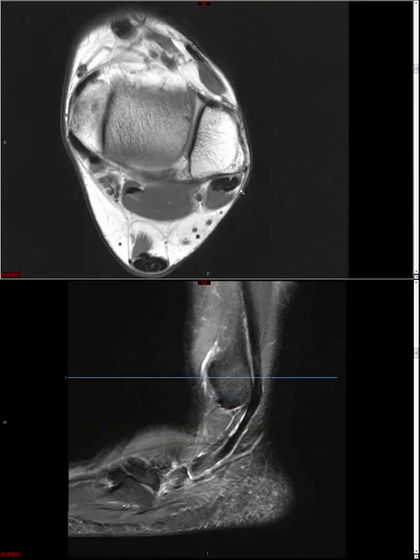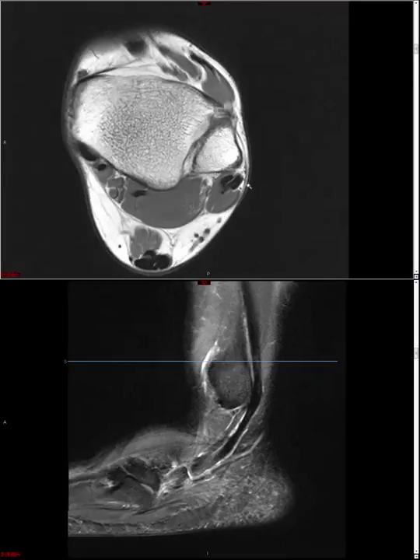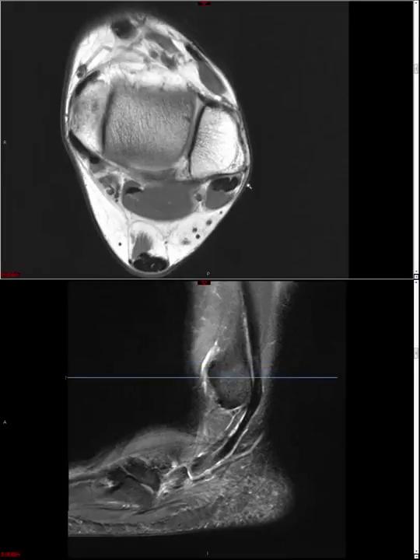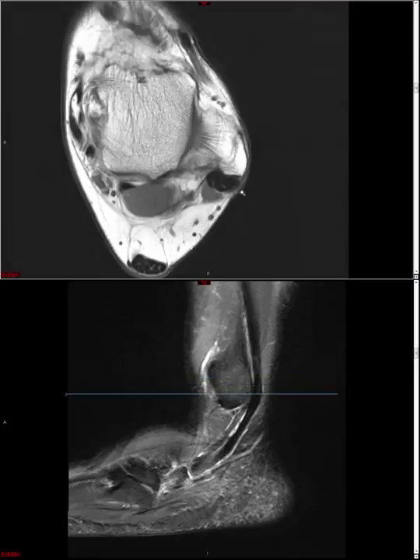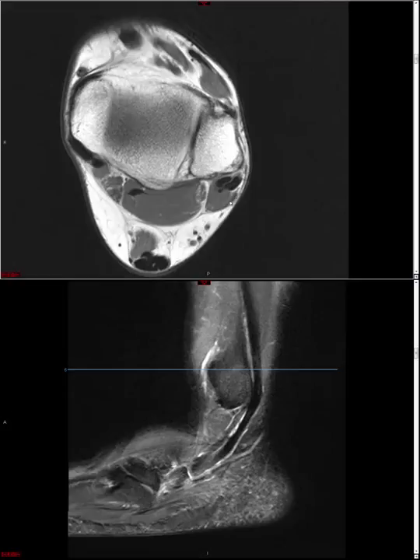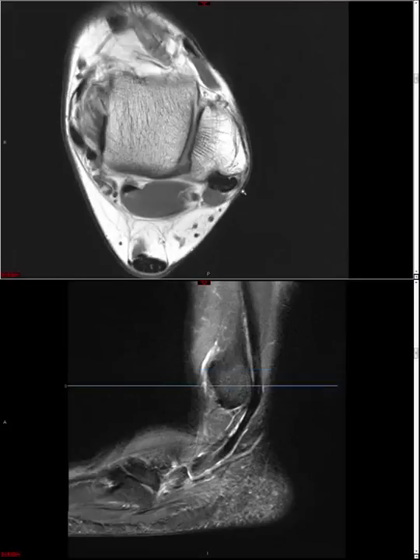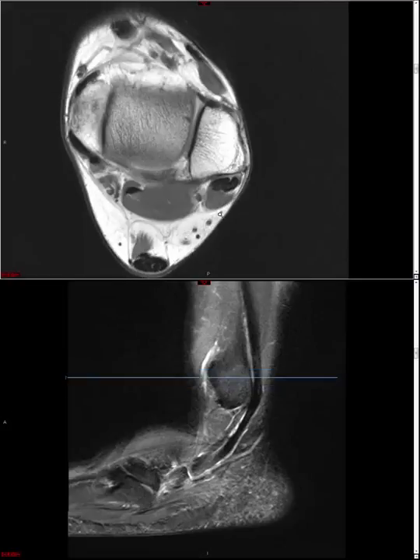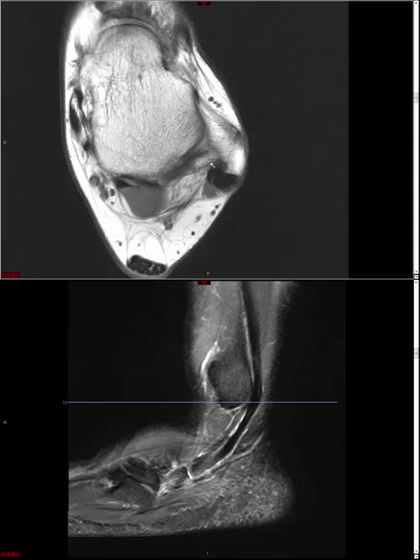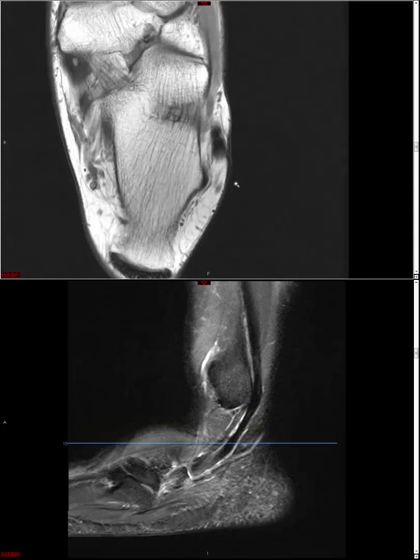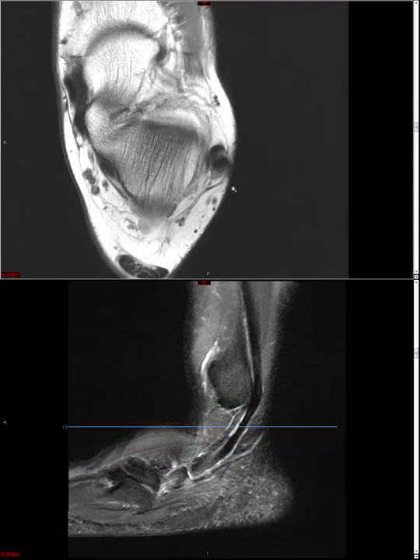Notice this thin band — this is the superior peroneal retinaculum. You may recall the plain film appearance of a fleck fracture of the distal fibula — that is basically an avulsion fracture of the superior peroneal retinaculum. If you see thickening of the SPR, you should also look for peroneal tendon subluxation.